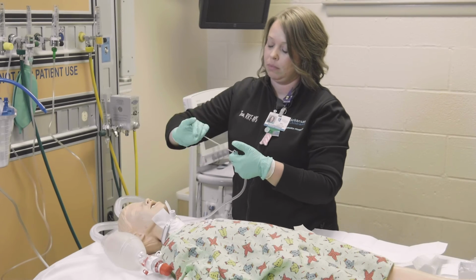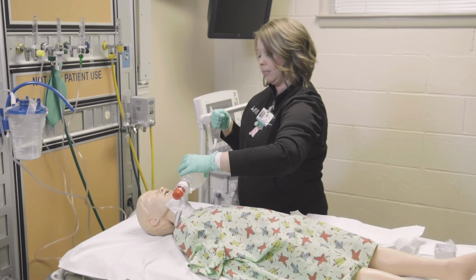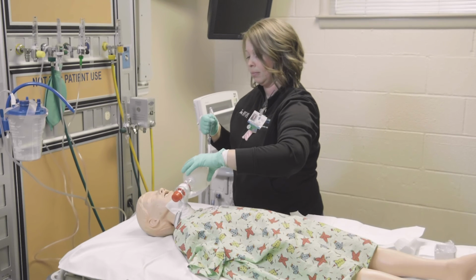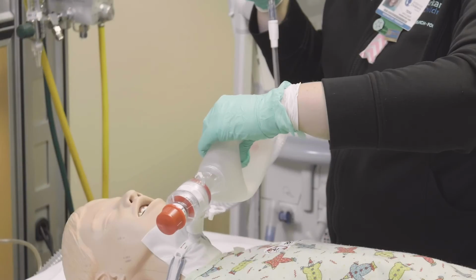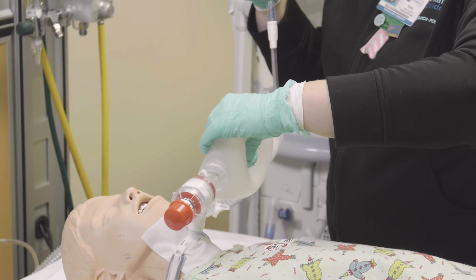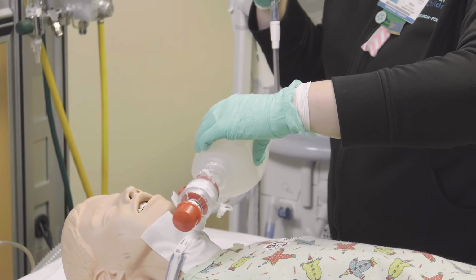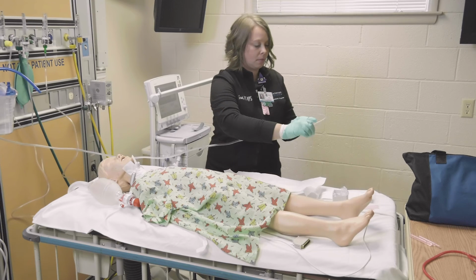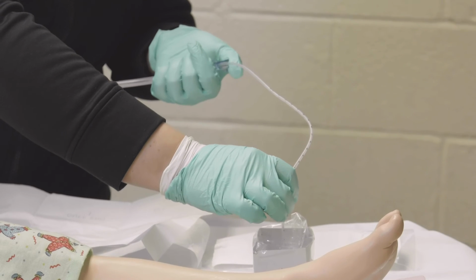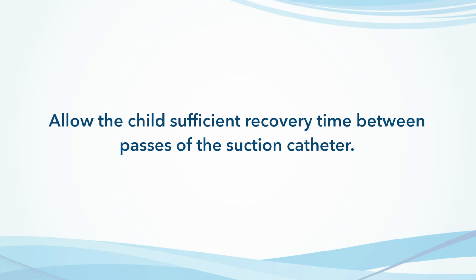Coil the suction catheter around the dominant hand and return the child to the ventilator circuit with the non-dominant hand. Hyperoxygenate the child after the suctioning event for 30 seconds. Assess the need for more suctioning and repeat steps for passing the suction catheter. Flush the catheter with sterile water or saline solution if indicated to maintain patency. Allow the child sufficient recovery time between passes of the suction catheter.